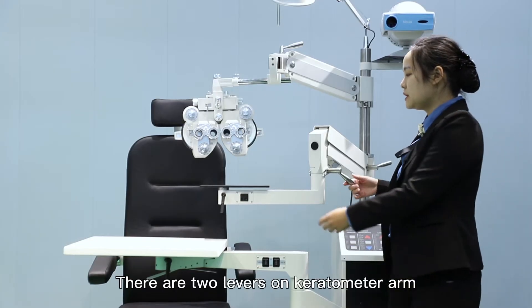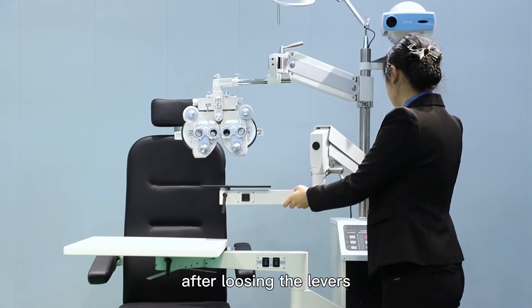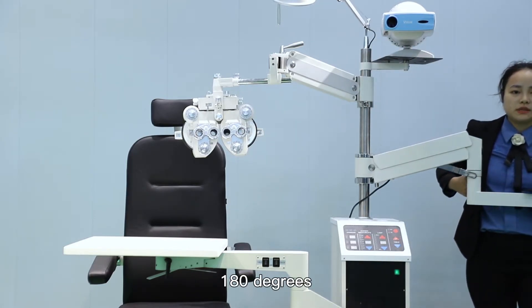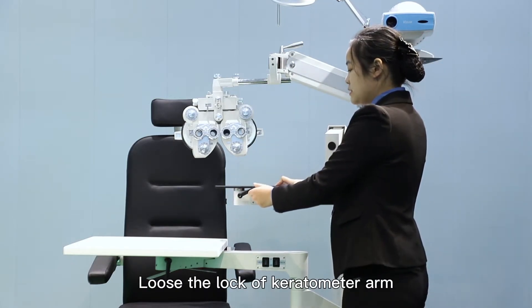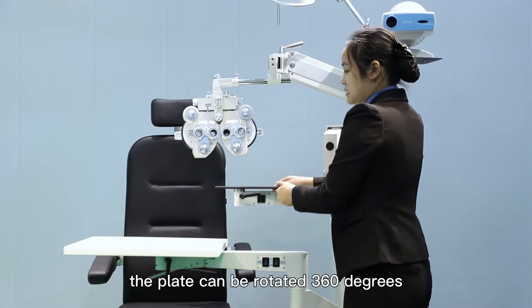There are two levers for the keratometer arm. After loosening the levers, the arm can be rotated flexibly to 180 degrees. Loosen the lock of the keratometer arm and the plate can be rotated 160 degrees.